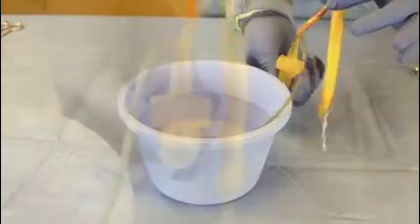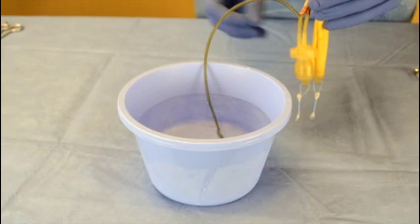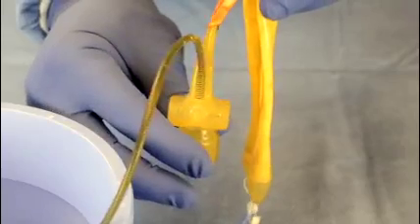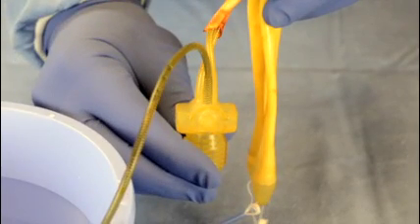Hold the pump so the pump bulb is on the bottom. Continue to hold it in this position throughout the prepping procedure. Keep the black tubing submerged when performing the following next 6 steps. Squeeze the deflation button one time and release. Make an initial hard, quick squeeze of the pump bulb.